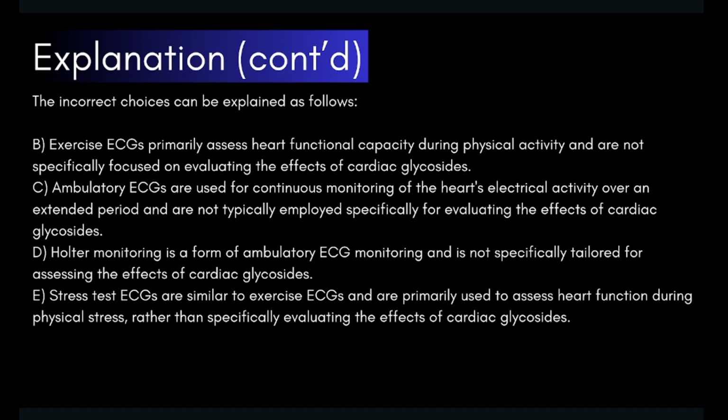Holter monitoring is a form of ambulatory ECG monitoring and is not specifically tailored for assessing the effects of cardiac glycosides. Stress test ECGs are similar to exercise ECGs and are primarily used to assess heart function during physical stress rather than specifically evaluating the effects of cardiac glycosides.